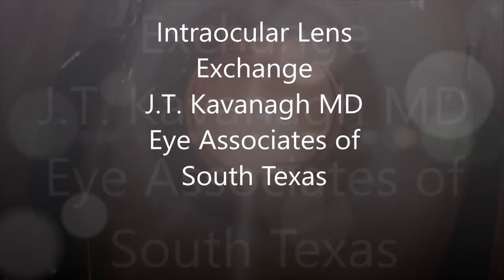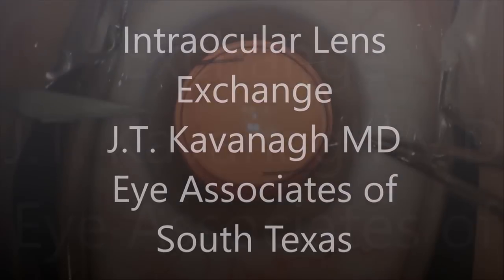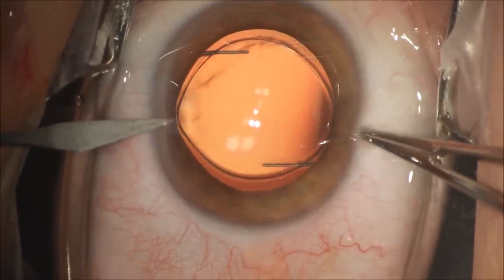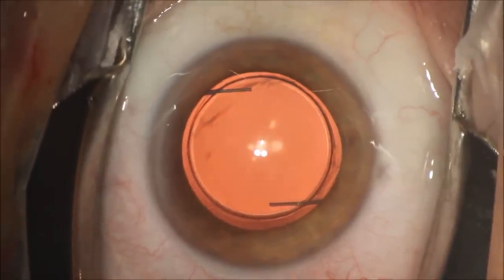I'm going to show you a case we did last week of an intraocular lens exchange. This is a patient who had a refractive surprise where the refractive result did not equal the patient's expectations, and we discussed the risks, benefits, and alternatives of exchanging the intraocular lens, and the patient agreed to this.